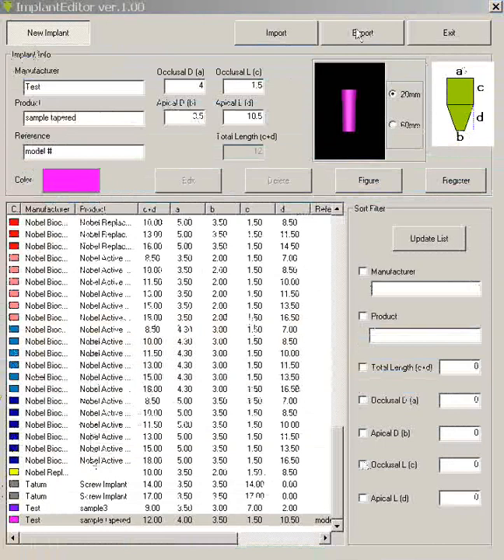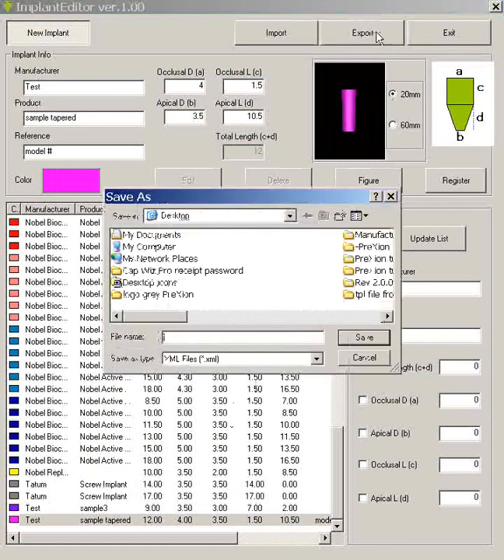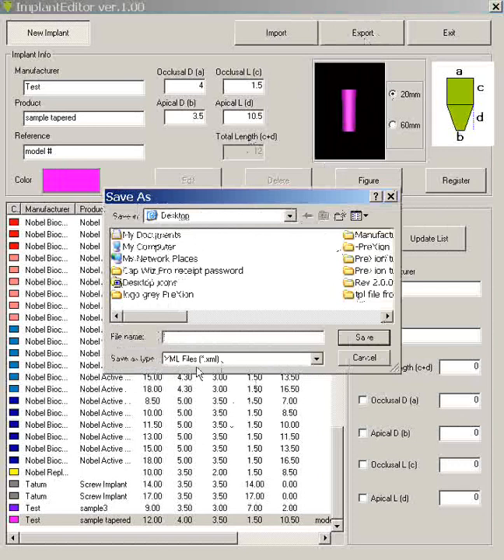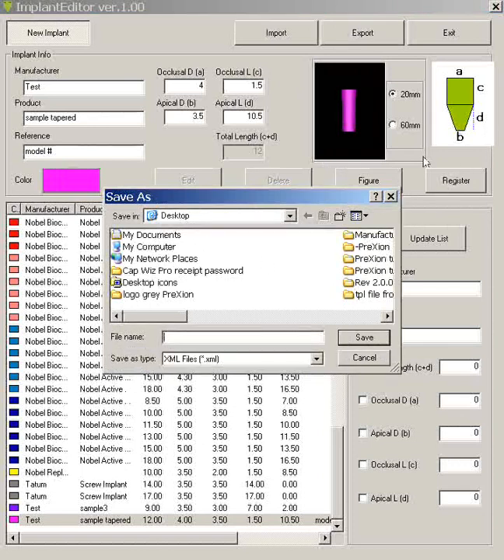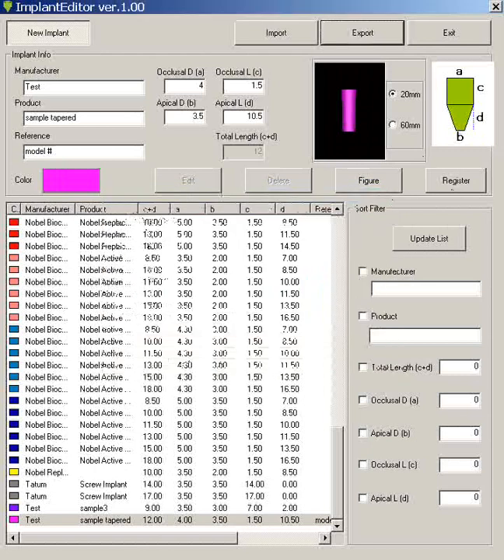Now the export function is really, I would suggest to use this after you create your file. And you want to save it as a backup let's say. You can click export and you could name it and just tell it where you want to go and you have a file that would be backed up. It's got to be an XML format. And then once it's backed up, wherever you want to send it to, whatever you want to name it, then you'll have that case. For some reason you want to change this out or you lose the file, you have a backup of your work. That's what that's for.